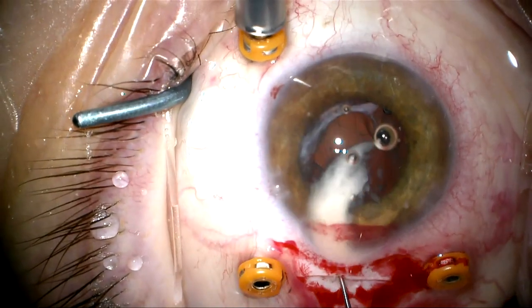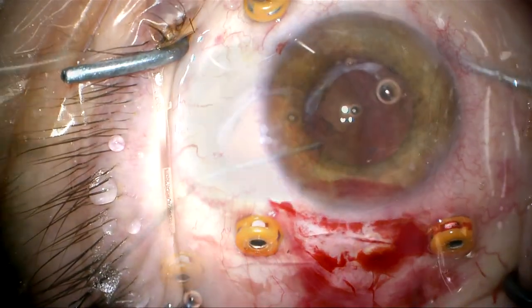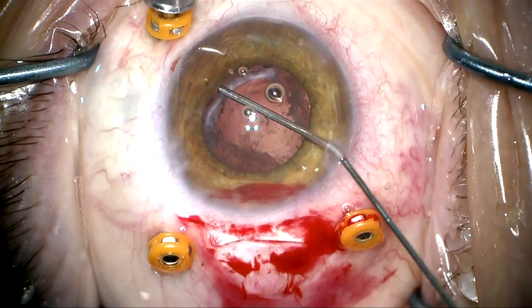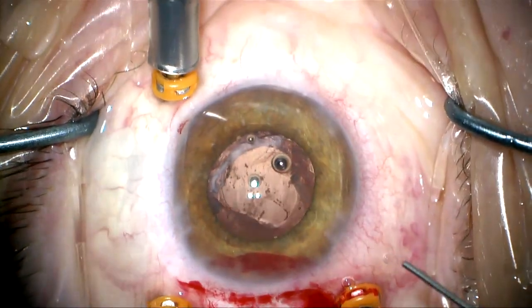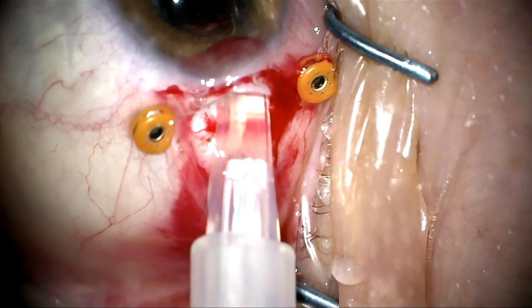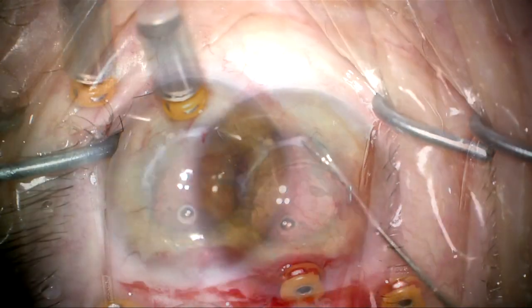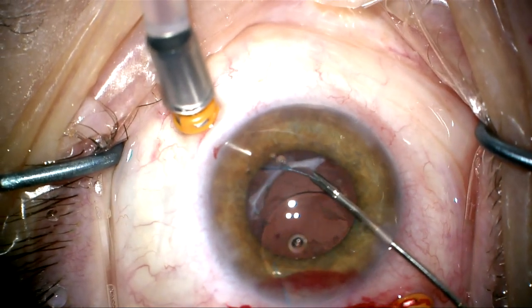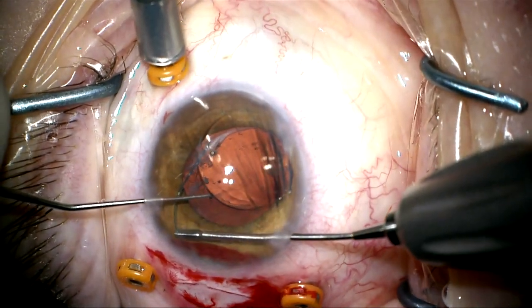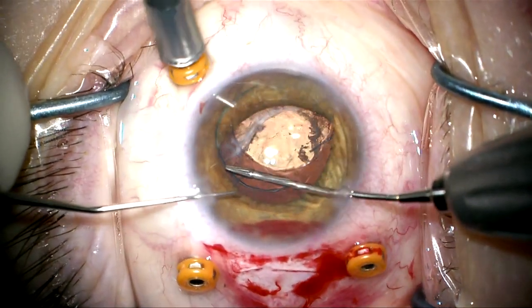Now I can get the rest of this giant Soemmering's ring out. The capsular bag fornix should now be pretty opened up. I'm going to use cohesive viscoelastic to make sure that 360 degrees there are no adhesions and the capsular bag fornix is open. Now we're going to place a lens — a soft foldable IOL — in the capsular bag fornix. I'm going to directly inject the haptic into that recess, making sure it's under the anterior capsule and over the posterior capsule. Then I'll take the second haptic and directly position it under the anterior capsule and over the posterior capsule as I rotate it into position.